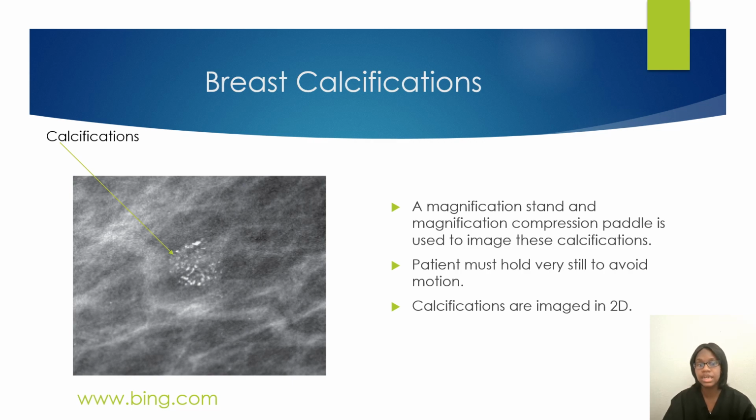Once the patient has been cleared in mammogram, that order will be canceled. But it's also good to have it in because sometimes you may have a doctor who does not know that these calcifications will cause streaking on ultrasound and that you can see them better under mammography.